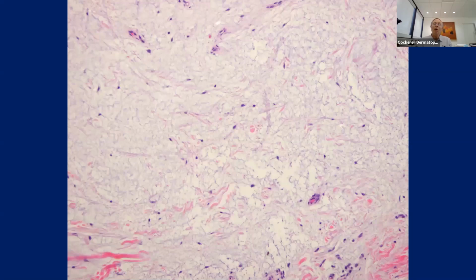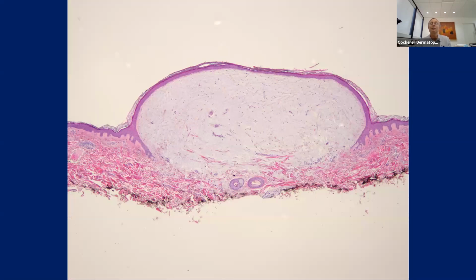Now, there are other scenarios where you can get mucin deposit in the skin. So you can get a deep diffuse mucin. We talked about this last week, remember? We talked about some of those weird cases where there was that kid that had Hurler's disease, a disease where they get widespread mucin all over the whole body, mucopolysaccharidosis. So you can get that.